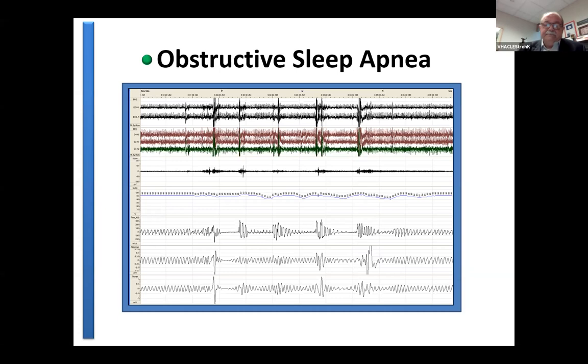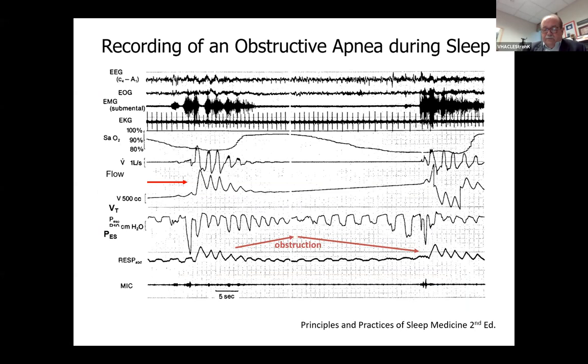So when you're looking at these records and you're looking for regularity, you go, huh, that's interesting. And when you're sitting there seeing regular breathing, you go, wow, is it that great? How would you design that? And a person who also speaks, also eats, also breathes, also spits through their upper airway. It's pretty interesting. Okay. All right, so that's a recording. We've seen that before.